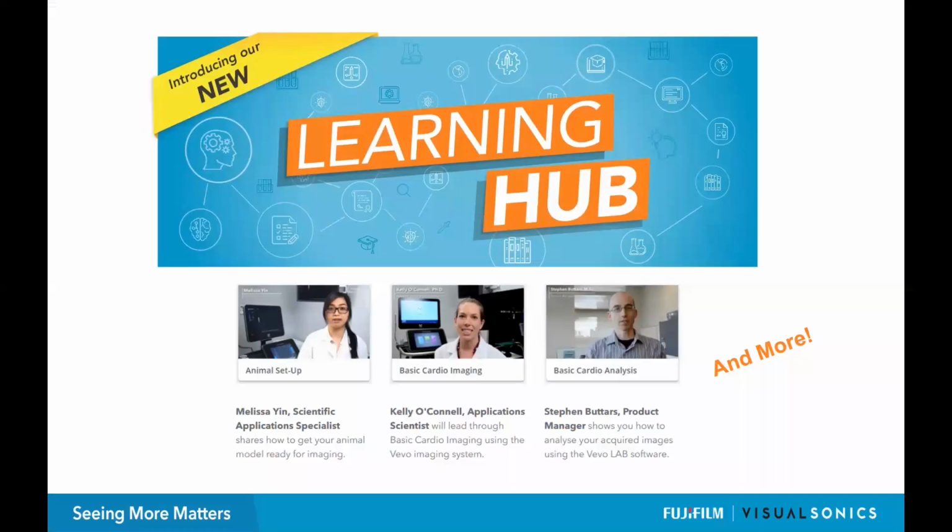One is to check out our Learning Hub that we have connected through from our VisualSonics website now, visualsonics.com. You can access our Learning Hub. We're starting to build out sets of training videos there where you can follow along, learn how to set up your animals, learn how to do basic cardio image acquisition or basic cardio analysis. We've been building out videos for 3D.